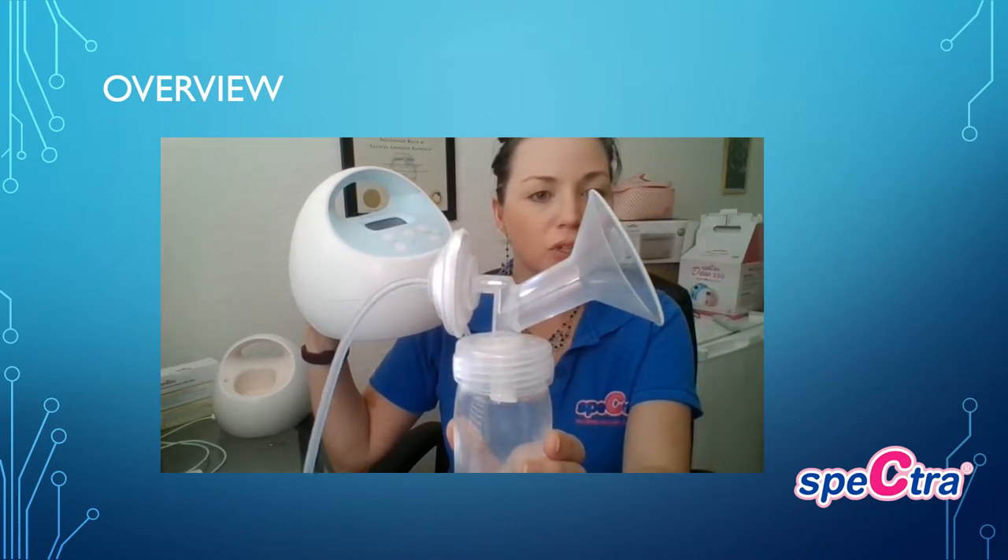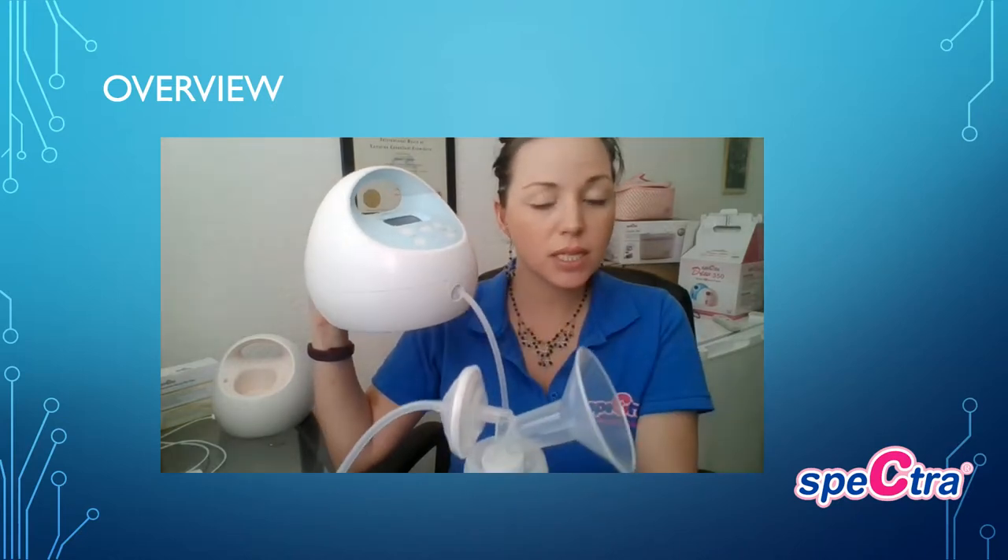If you are experiencing any loss of suction or notice suction is less than normal, usually the culprit is going to be the tubing — make sure the tubing has no holes. It could also be the backflow protector; ensure that it's securely pressed. We recommend the backflow protectors be replaced about every three months. It could also be the duck bill valve itself — make sure it's closed. If you notice it's been warped and opened a bit, that could be causing suction loss. Replace those about every three months as well.